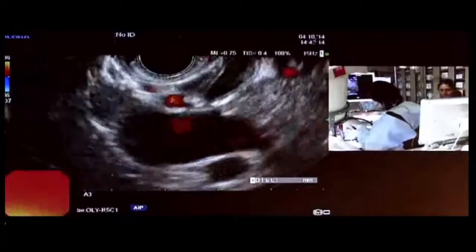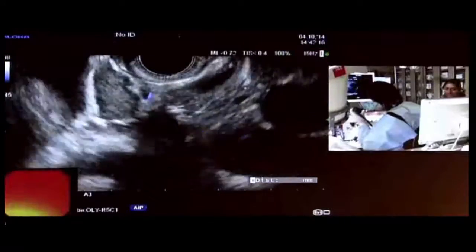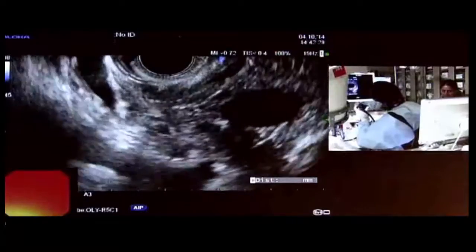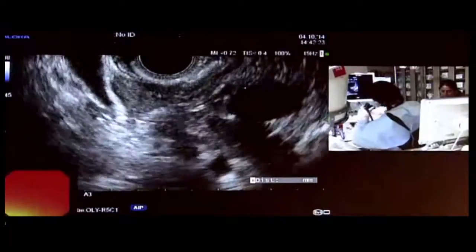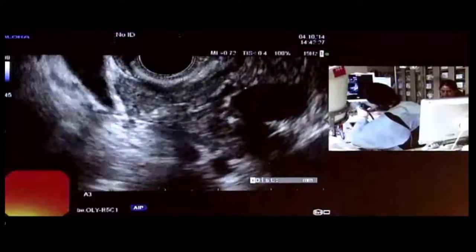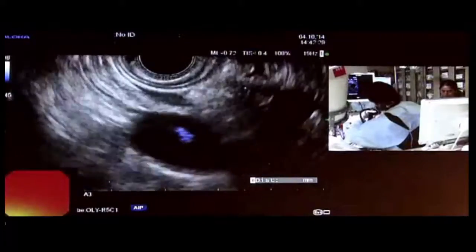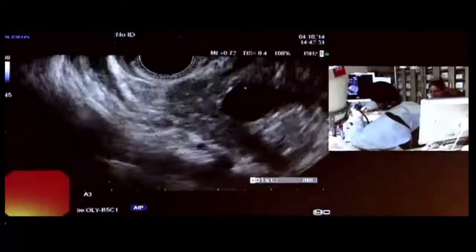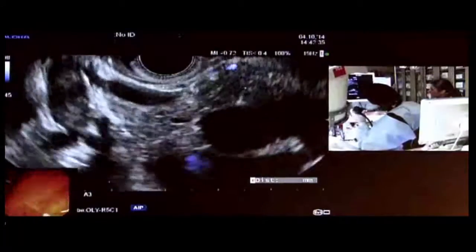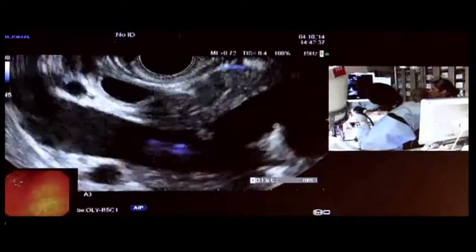All right, so the anatomy is a little confusing. We know where the bile duct is. We saw something that looked like that PD, is that like a branch? But then there's a structure right below it that I thought is vascular, but it's not lighting up, which is strange. Is that the PD? I think that's initially what I thought. That was my impression. Yeah. So the thought is that this is the PD, and it's starting to.